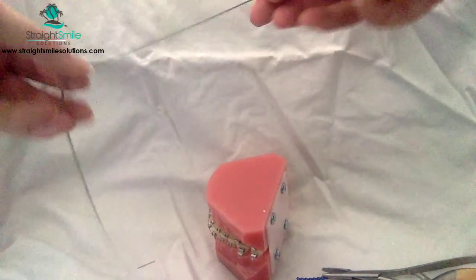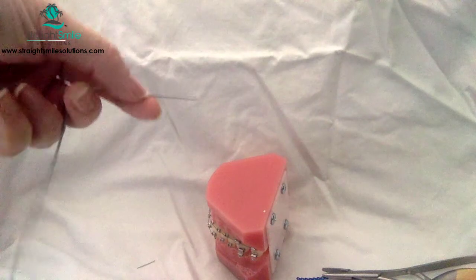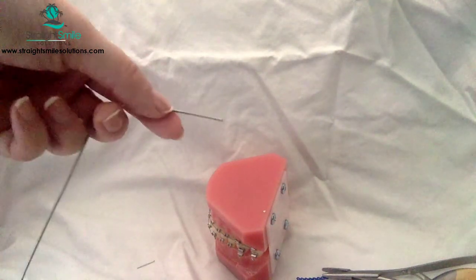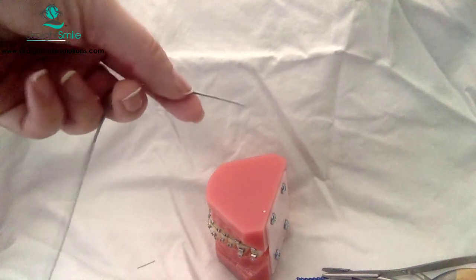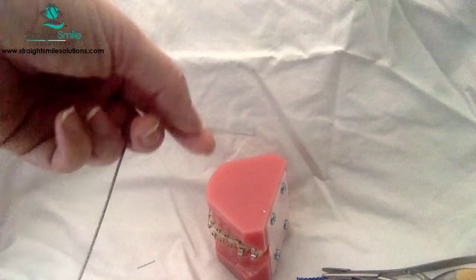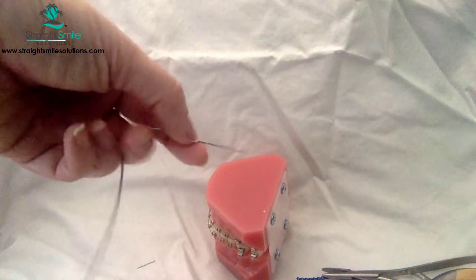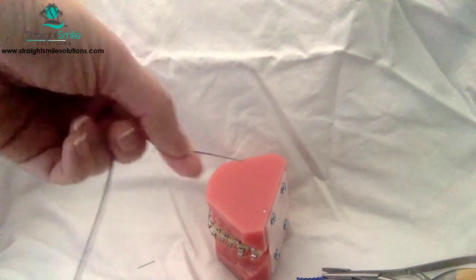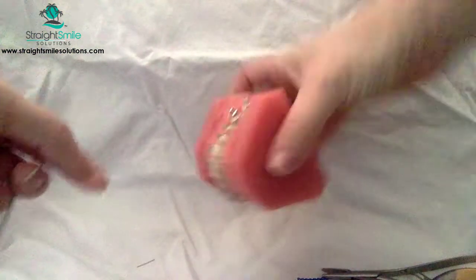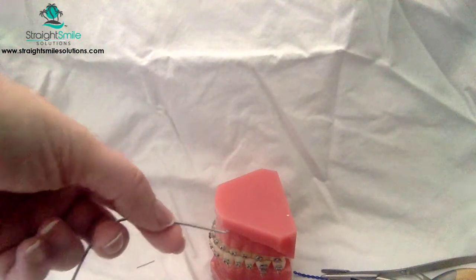Also, where you see some long spans in your Typodont, I want you to practice tying in a little bit of closed coil spring. Closed coil spring is great for keeping a wire from bouncing around, for stabilizing it. Make sure you measure this precisely. It shouldn't be able to spin around, move around, or go back and forth. Measure the exact diameter. It's better to overshoot than undershoot and cut it down. Fill up any big spaces with closed coil spring, and then cinch back the distals.